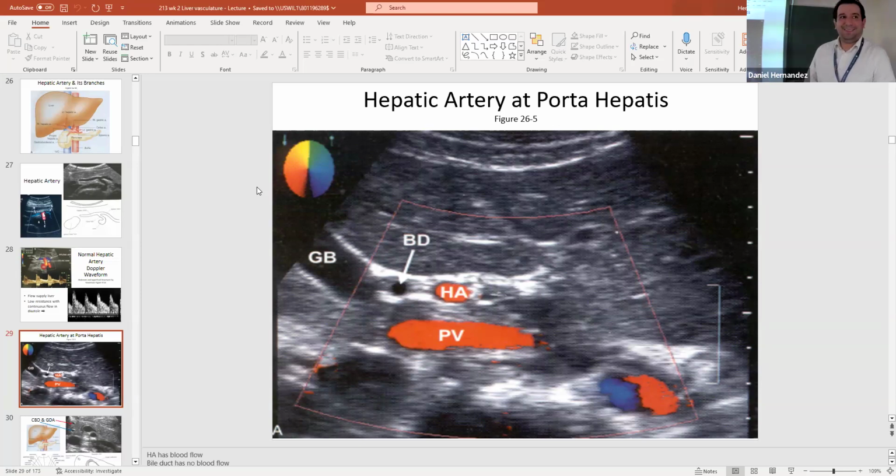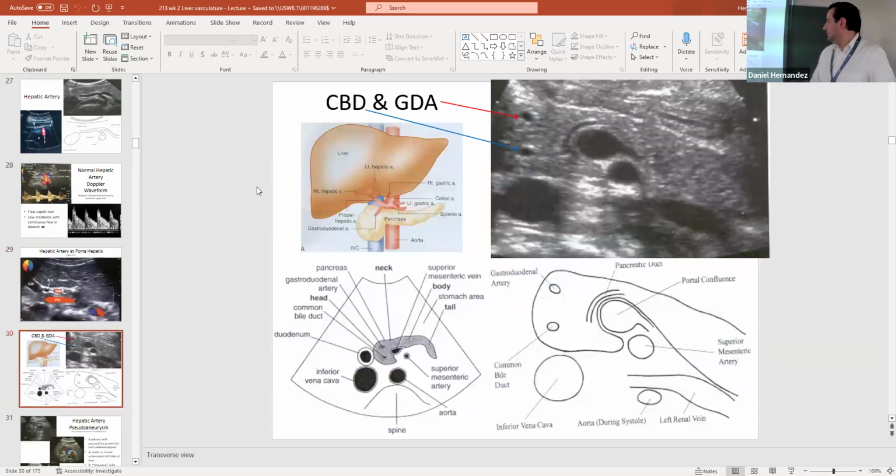I hate the common bile duct. But I really don't even think that's it. And they were measuring it, I was like, no. Yeah, that is it. No, because you have to measure the common hepatic and the common bile. Most of them don't measure that. They're starting to. All the hospitals do now.